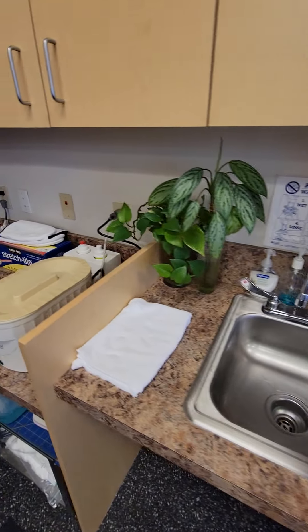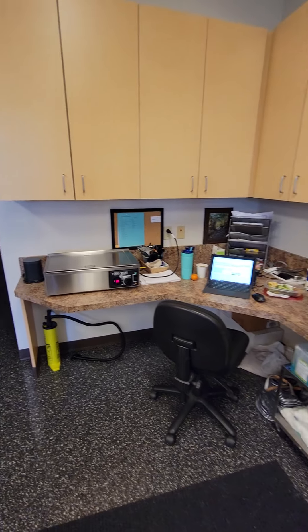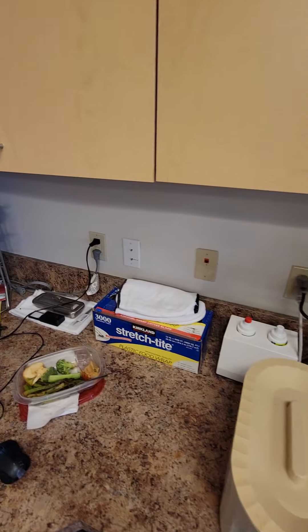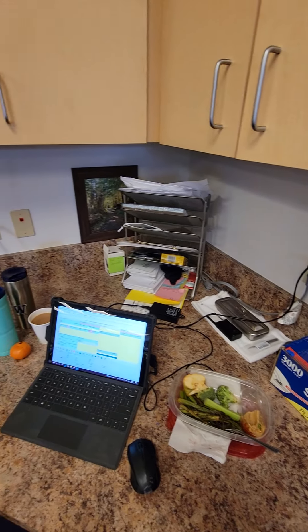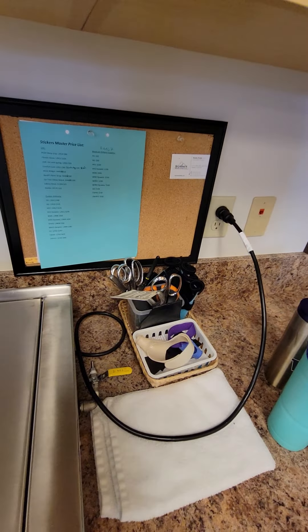Moving on over, I'll just show you the pertinent areas. This is our little OT desk area with the paraffin and ultrasound gel. A splint machine with the scissors.